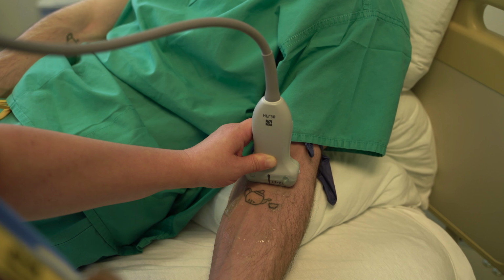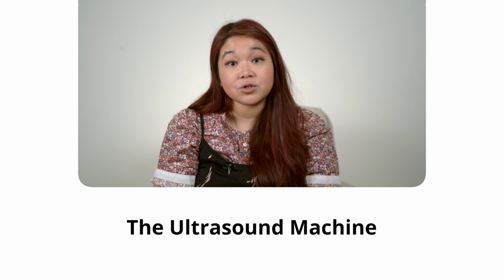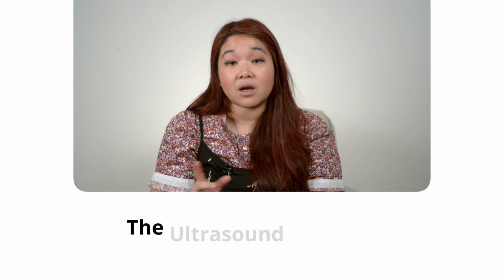The color does not differentiate arteries and veins, it's important to note. Next, we'll move on to exploring the actual machine itself and some key points on ultrasound technique for when you use an ultrasound machine for procedures. So the ultrasound machine itself is a fantastic practical tool that has vastly improved the success and the safety of vascular access and regional techniques, its main applications in anesthesia.